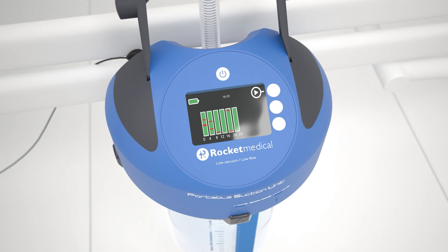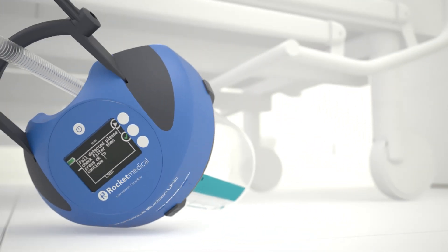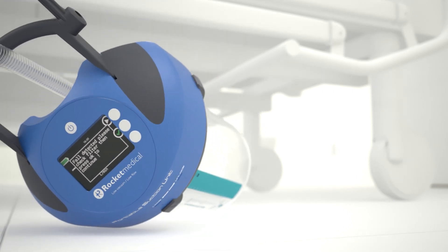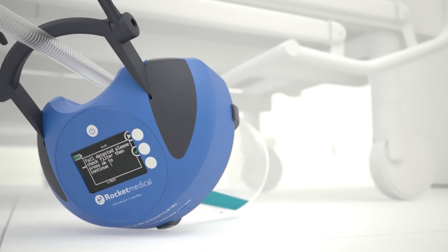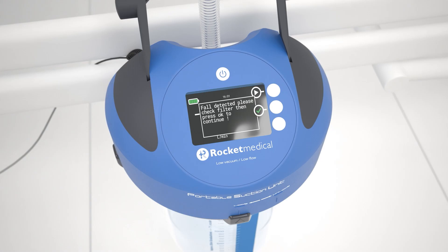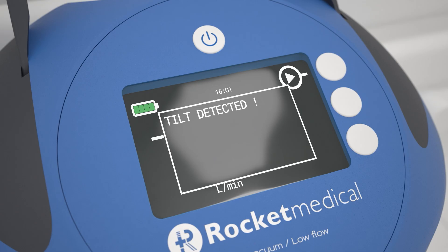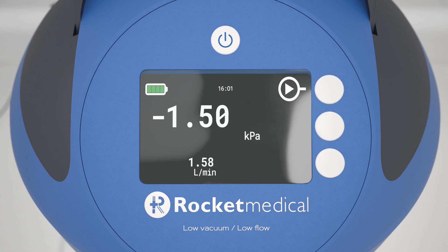If the PSU and chest drain unit tips or falls over, an audible alarm will sound and the tilt or fall screen will be displayed. If the tilt screen is displayed, the screen and alarm will switch off automatically when the device is returned to an upright position. The PSU will continue at the programmed suction level. If the fall screen is shown, check and if necessary replace the filter, and then switch off the alarm and screen manually. The PSU will continue at the programmed suction level.